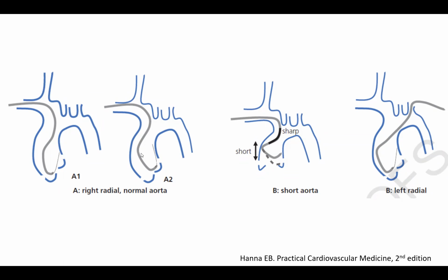The sharper that bend, the more you lose support on the catheter, because the natural propensity for that catheter is to get elongated and spring out into the aortic arch. So it's unnatural for that catheter to want to stay here. It wants to jump out and embrace its natural shape. So that twist here reduces the support of the catheter because that catheter is under tension, okay?